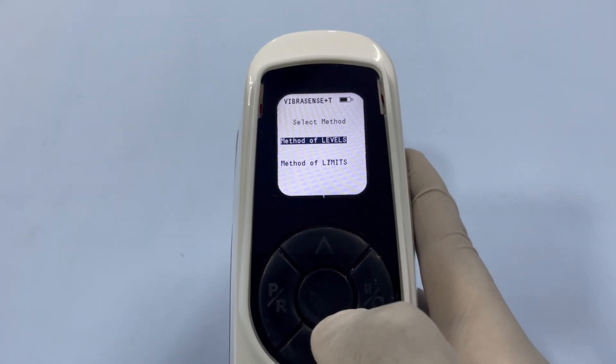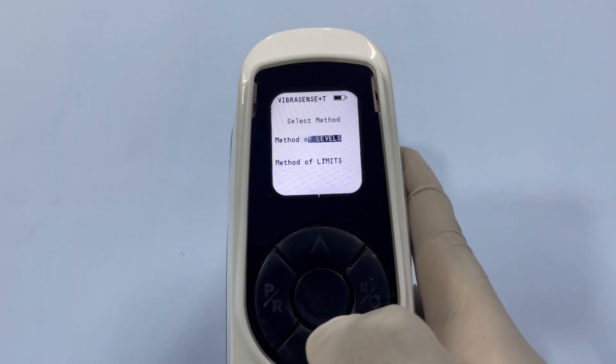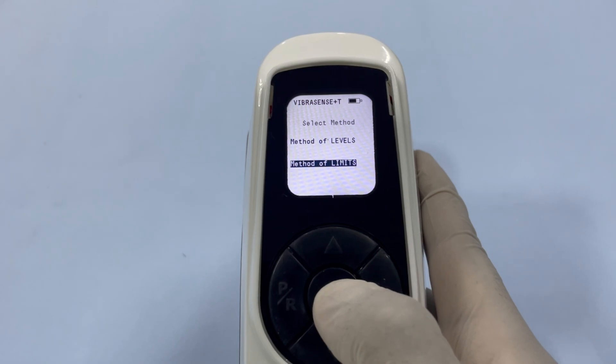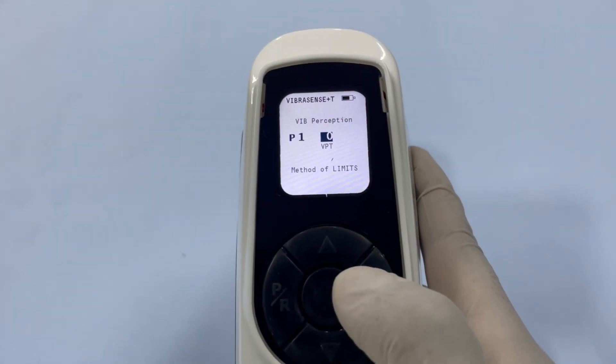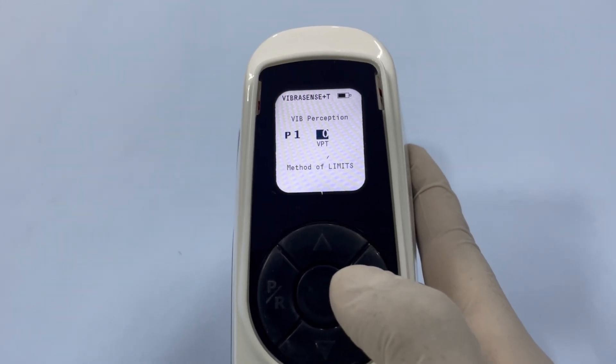Next, choose your testing method. In the Method of Limits, the units will increase by one, while in the Method of Levels, they will jump to preset levels. This is the vibration perception test screen, where the default setting will display position P1 and VPT zero.